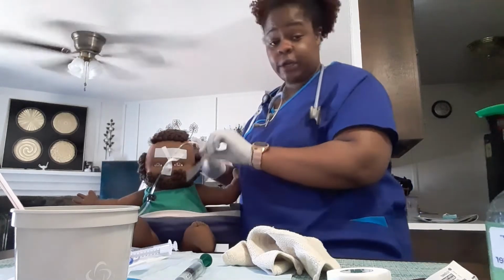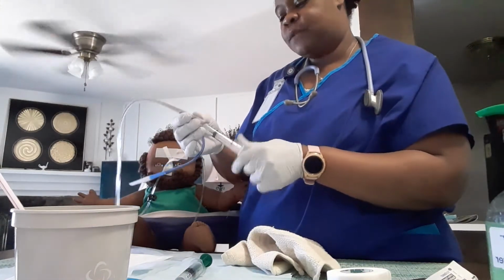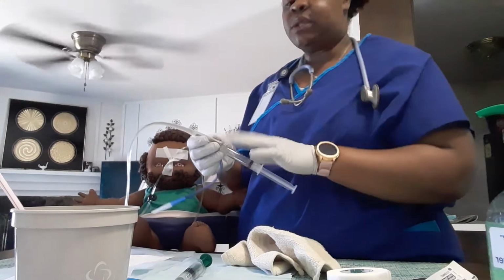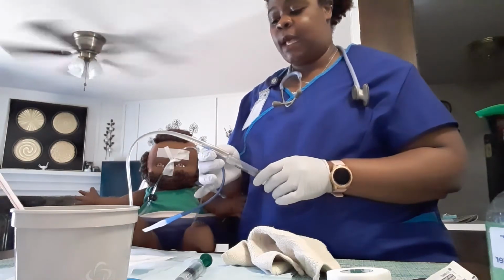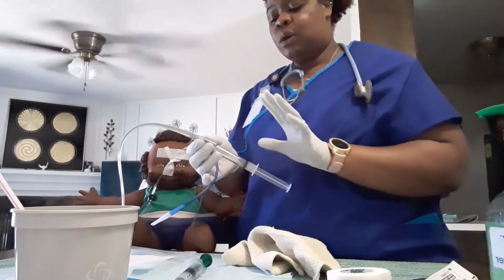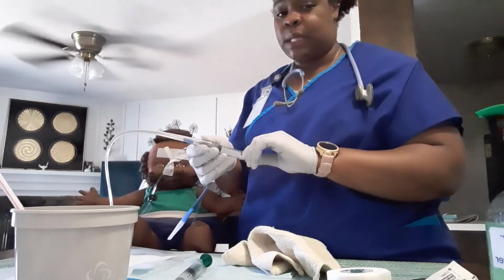So it is secured. My tubing is in the belt. I'm getting some content back. So I'm going to draw off 10 mLs of my gastric content, and with this content, I would test the pH. I will also get an x-ray done if we're going to be using this for any medication or feeding. Once I've confirmed that this gastric content is normal, I will replace it back.